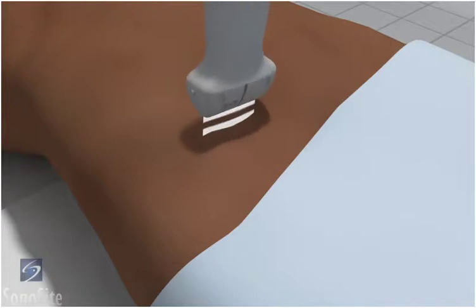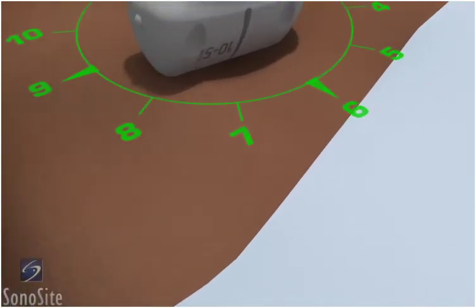The transducer is placed transversely just inferior to the inguinal crease with the orientation marker directed to the patient's right at a 9 o'clock position.